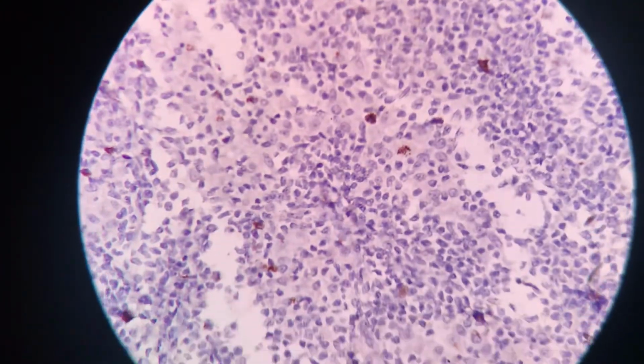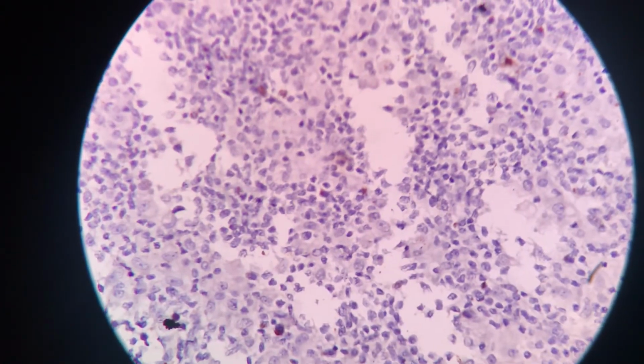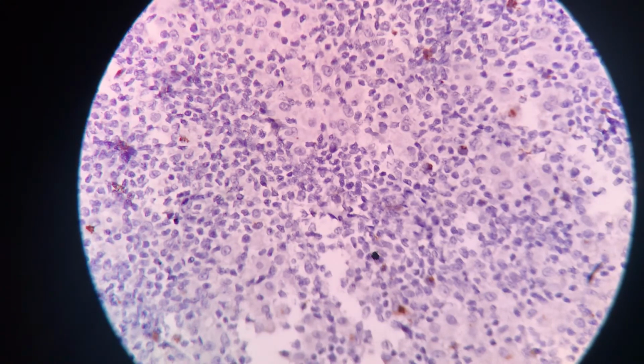So here in this case, for quality purpose, it should stain the granulocytes and occasional large cell with Golgi zone pattern of staining. So that concludes the CD15 part of the analysis.